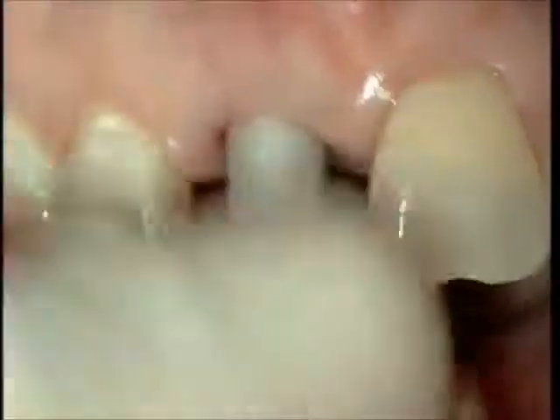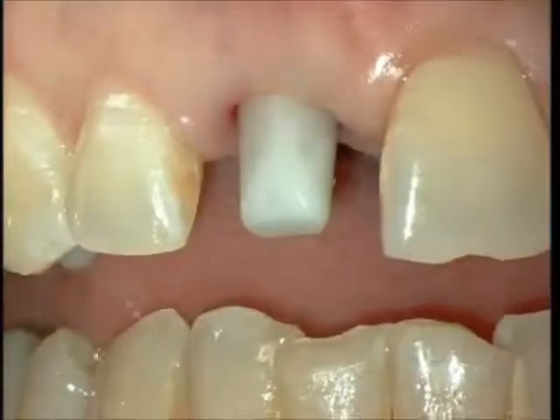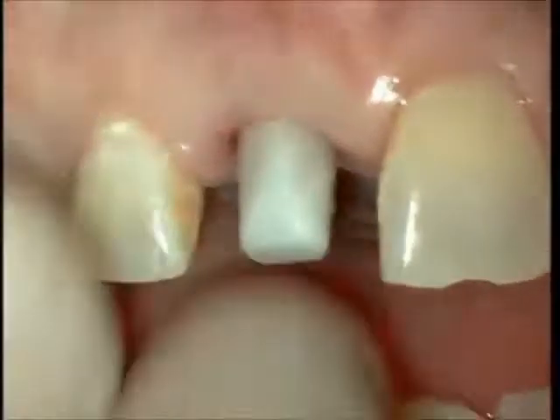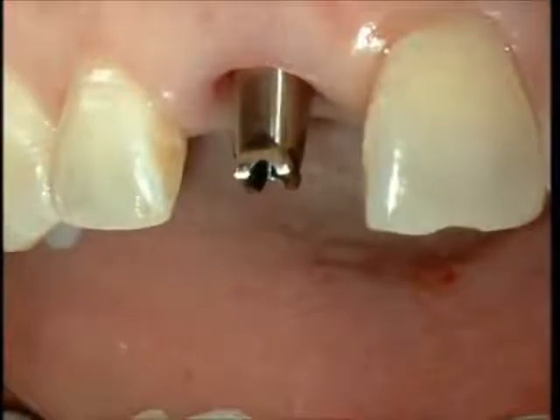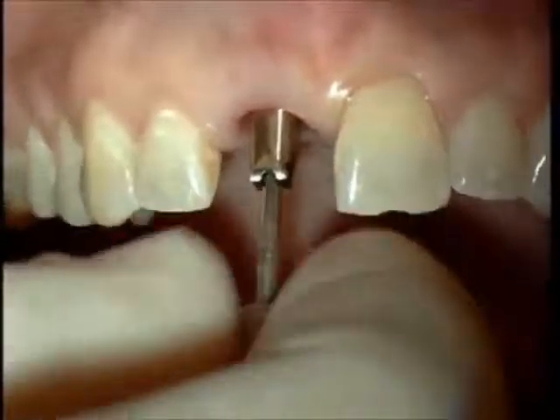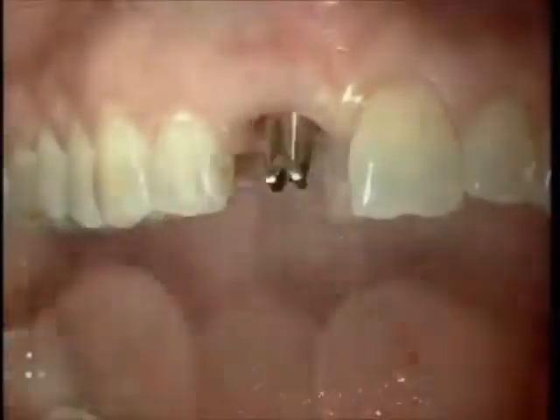And you see us going through the process here. This was the temporary that was given to us by her restorative dentist, and I can reline this rather easily at 8 weeks with not much to do in terms of time. It will capture the margins, and I'll be able to reline it out of the mouth. Screwing this down, just hand pressure. This allows us now, we can leave this in the mouth, never having to take it out again.